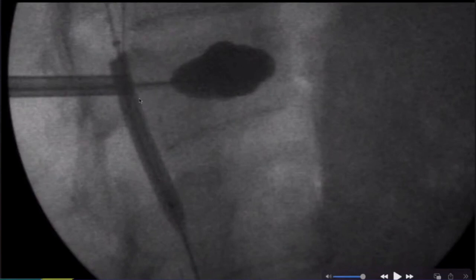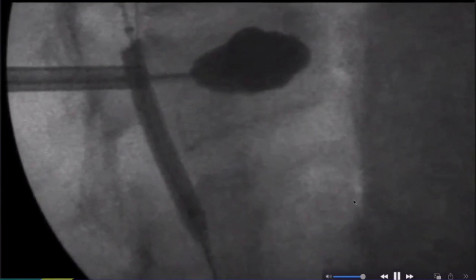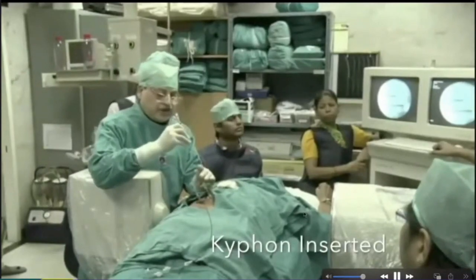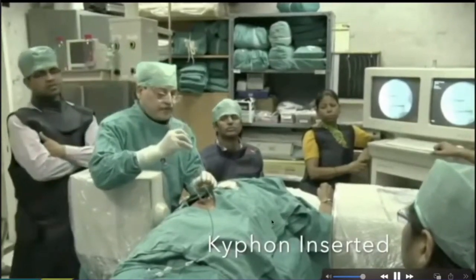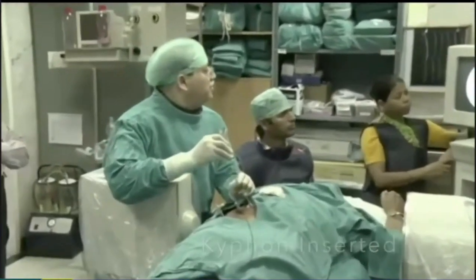And thirdly, visualize. Suppose there's something going wrong at the posterior margin. How would I know it? This balloon shows me everything. So what I'm doing in there really gives me a visual impression. And I keep inflating and deflating these two balloons alternately, to maximize the anterior vertebral height and not to cause a posterior retropulsion, further retropulsion, which happens per procedure. Many people do it. When they inflate the balloon, they get more retropulsion. That's a big worry. That is one of my workshops, and that is how we are doing it, putting a balloon right up to the anterior margin.